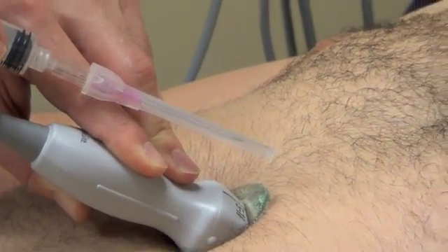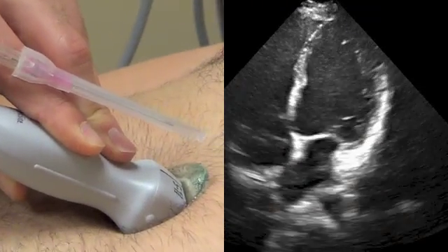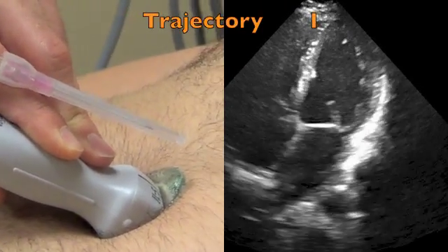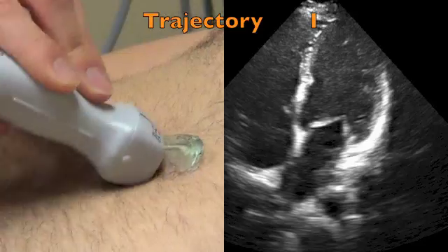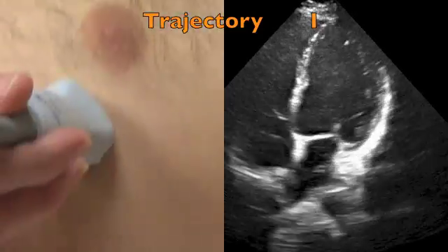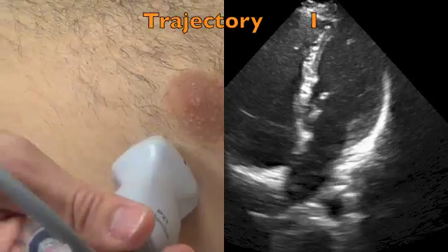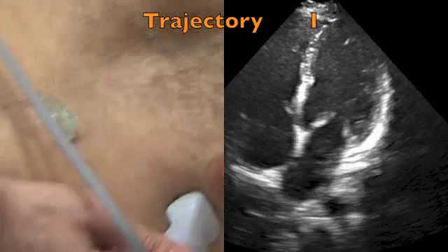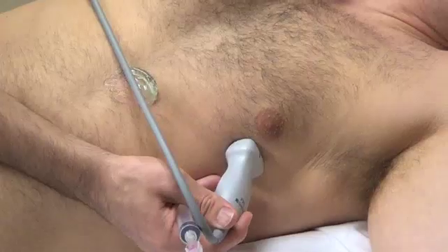Often just five to ten cc's of fluid can be enough to reduce the tamponade physiology. If you're going to go for an apical approach, you can roll the patient onto their side in order to get the fluid to settle towards the apex of the heart.